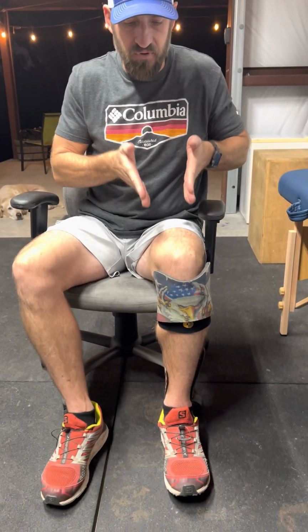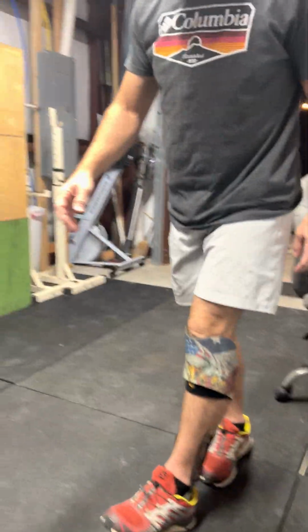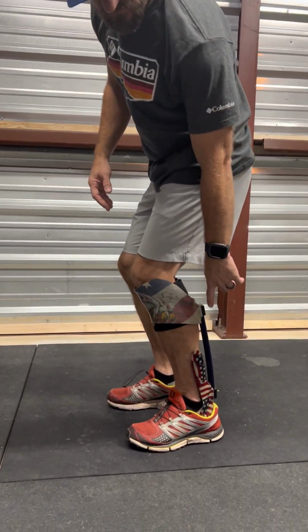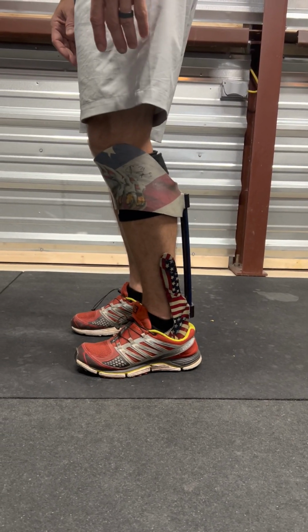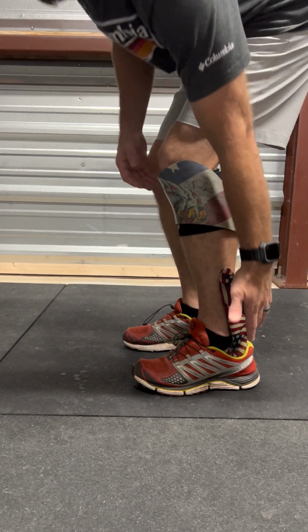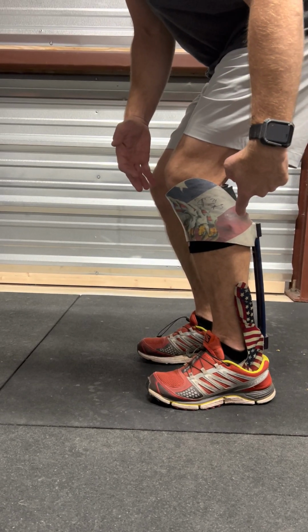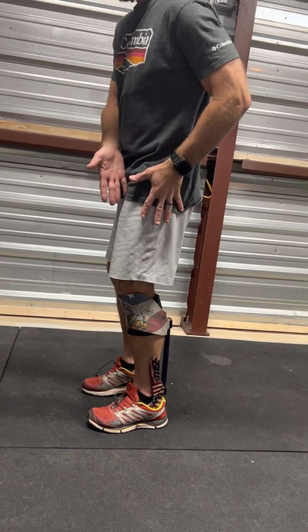There was a question about axial loading, which is pretty much just the pressure of your body going straight into something, straight up and down. That's an axial load. And how it's done, with the cuff, when you're wearing your device, whenever that knee goes into the cuff, you can see the strut moving here, right? And that's my knee going into the cuff. When I'm doing that, I'm pushing my heel down into the ground at the same time, and I'm putting pressure through my forefoot, and I push my knee forward. That's how you do it. If I don't push my heel to the ground, it rolls forward, right? So then my axial load on this leg is going that way.